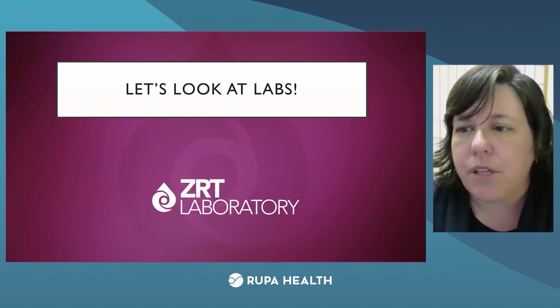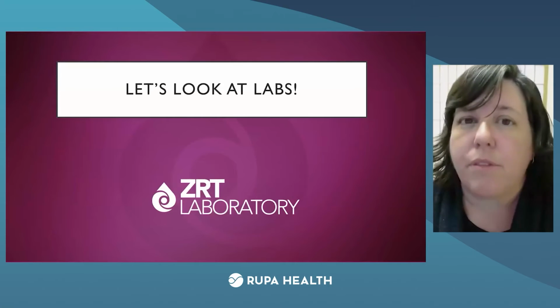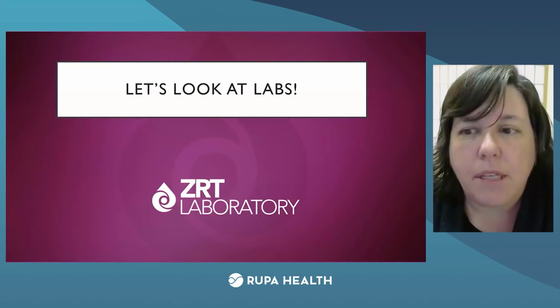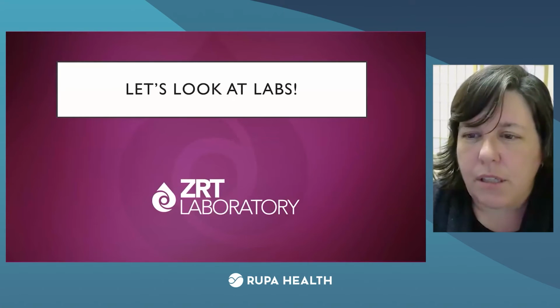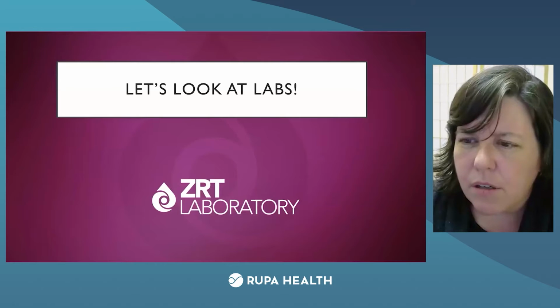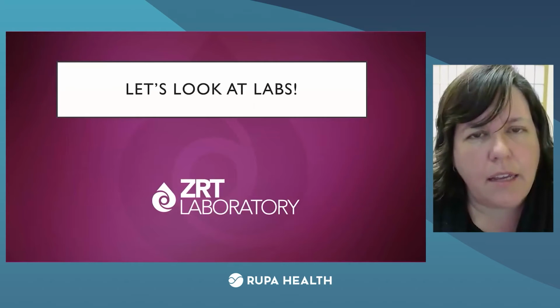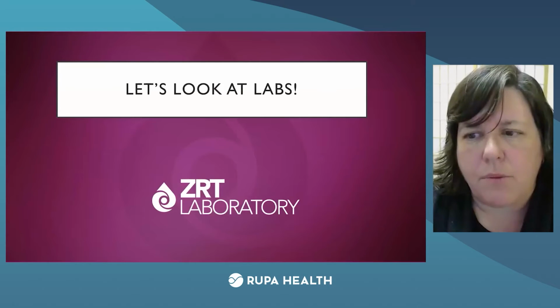So this person also said, though, that they had antibodies, and postpartum thyroiditis is common. In this situation, she was saying clinical thyroid stimulating immunoglobulins. So in this situation, it looks like she may be, let's see here, below standard. So T3 and T4 are low, but the thyroid stimulating antibodies are high. Interesting. Usually that will give you a hyperthyroid situation.